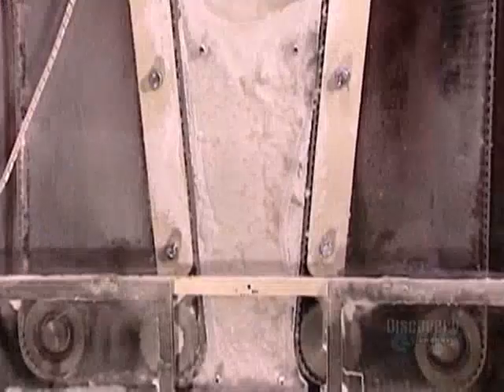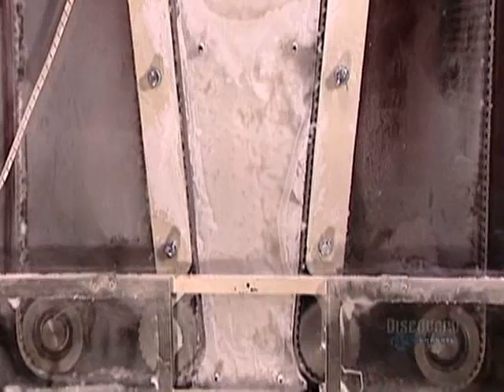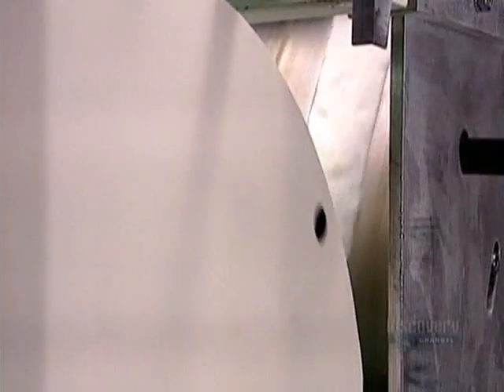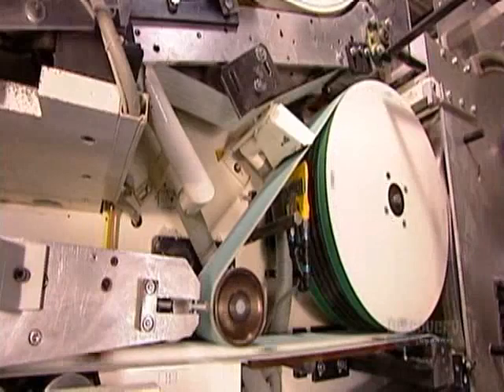The polymered fluff then travels through what's called the doser, a device that measures out the required amount of fluff per pad layer. The machine then suctions each dose into a closed chamber where an air current blows it into a pad-shaped mold. Then another air current blows it out of the mold onto a wheel that transfers it to a conveyor belt. The machine simultaneously makes a second pad layer.